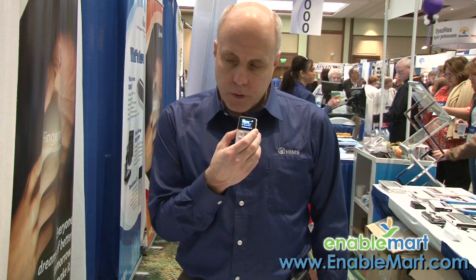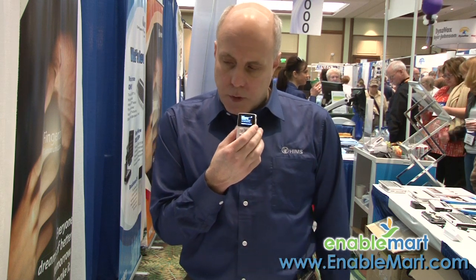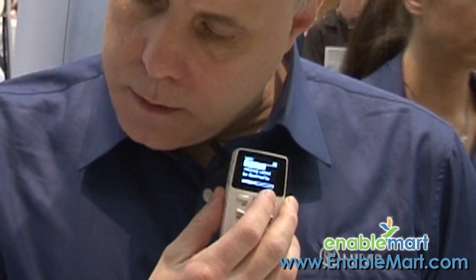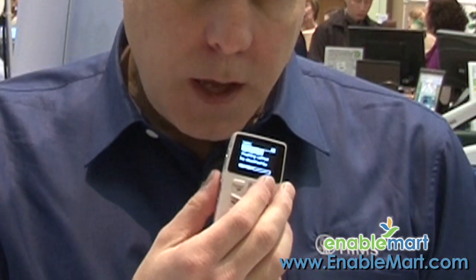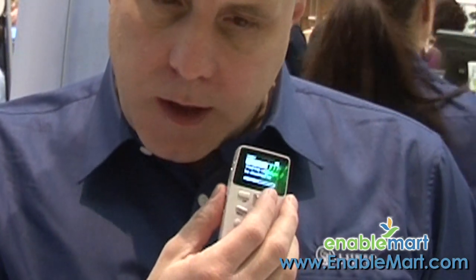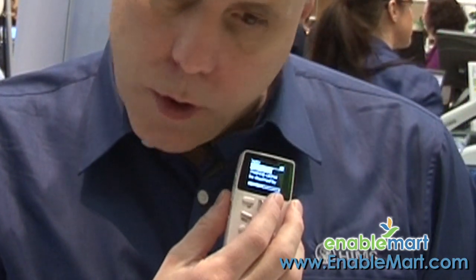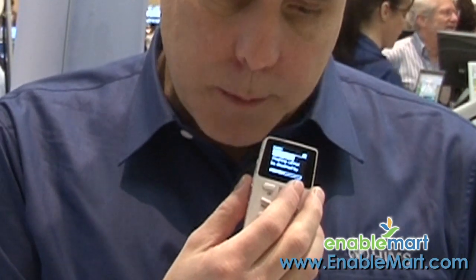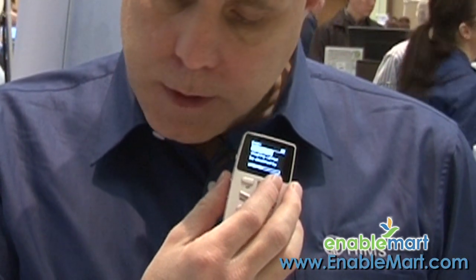I'm going to show you a couple of examples of some of the formatting that this device will read. Before I get into the different types of books, let me remind you that if I press the record button, it is a very quality recorder that will record your lectures, phone numbers, or anything else you would need to record. Now I'm going to press the right arrow button, which is changing how the BookSense is going to jump through the document on the screen. So I can read by character, phonetically, search for a word, move by level — which is basically like chapter — with level 2 and 3 being sub-chapters — phrase, paragraph, heading, and so forth.